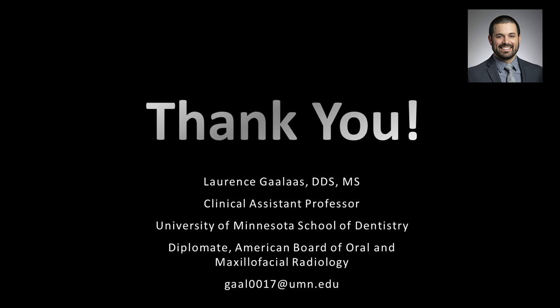And with that file transfer service, we can move scans and reports securely, very quickly. Another secured service we use at the university is Box. So if it's a HIPAA compliant data transfer service, it works to send scans. My side note on that is to export in a DICOM format. There are some software programs that will export a wrapped viewer that's convenient, but sometimes locks you into that viewer and won't let you do some of the more fancy analyses you could do if you just had the DICOM and could open it in a different software program.